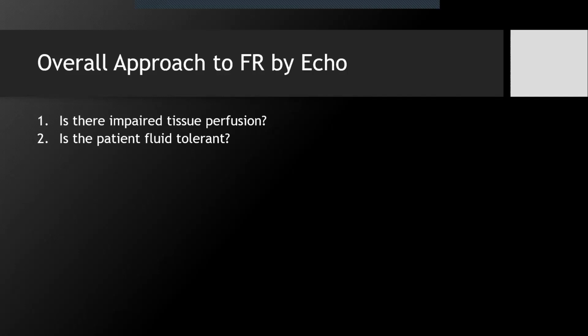But if the answer is yes and yes, and you're thinking that maybe giving fluid will be the best way to increase their cardiac output, increase their perfusion, you have to ask yourself, how will I simulate the fluid bolus? What are my options?